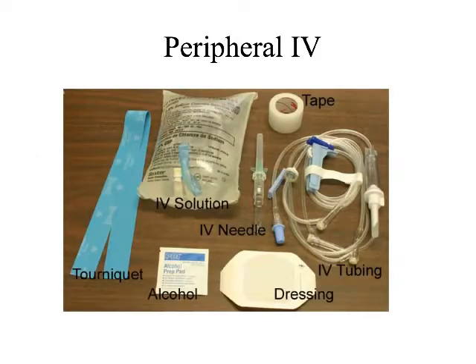And I think it's very, very smart prior to doing an IV to get your supplies all together in one place. Because what happens if you're halfway through the IV and the patient's blood's going all over the place and you don't have a little screw-on cap to put on the thing? That's a problem, right? So generally what I do is I almost make a little sterile field, an area that I've cleaned off. It's not quite a sterile field, but I've cleaned off this area, and I've got all my supplies lined up. I've pulled off a few of my tapes.